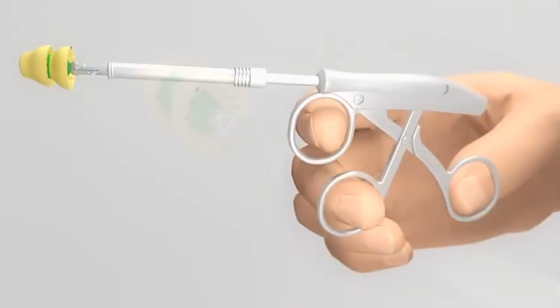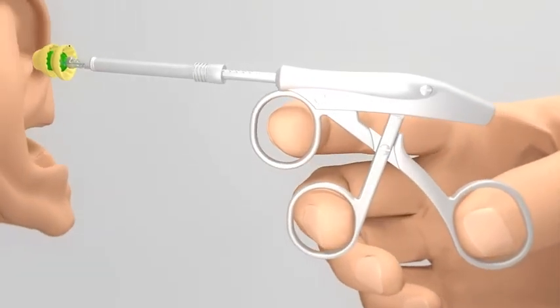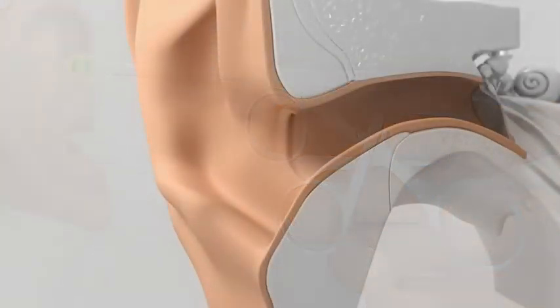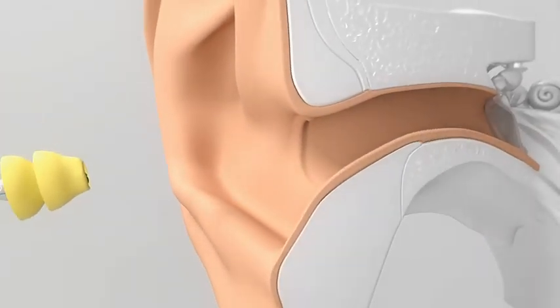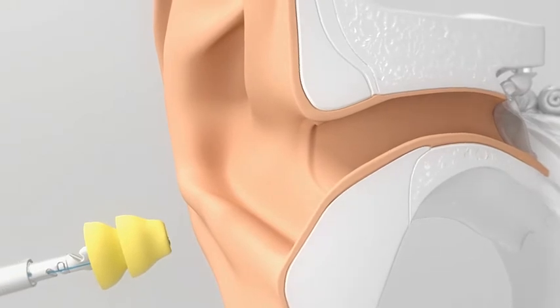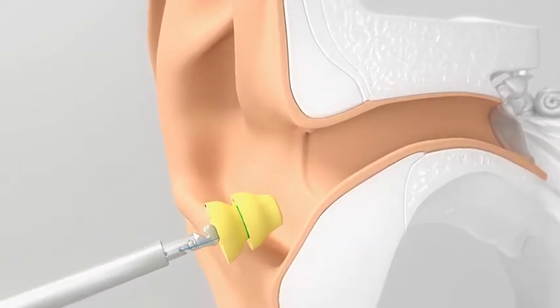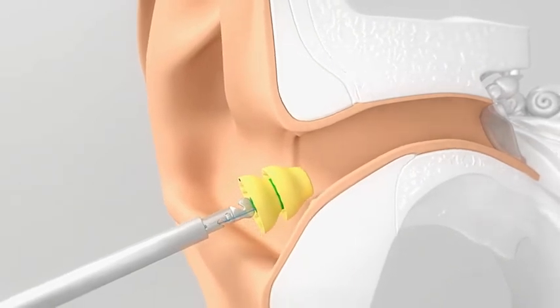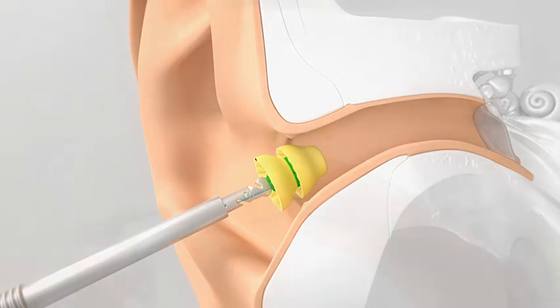Prior to insertion, gently apply lubricant. You are now ready to insert the sizer. Ear canals vary in shape, however most have a slight S shape with a gentle rise. Again, diligent otoscopy is important for successful placements. Insert the sizer according to the shape of the canal as observed during otoscopy.